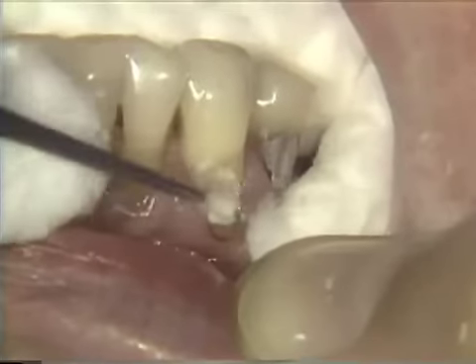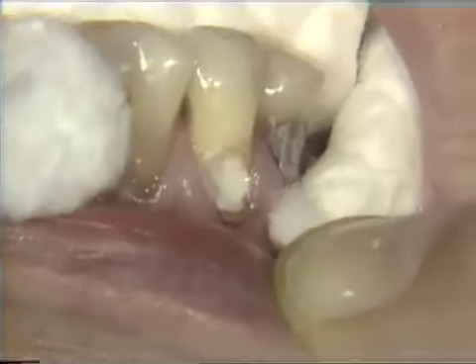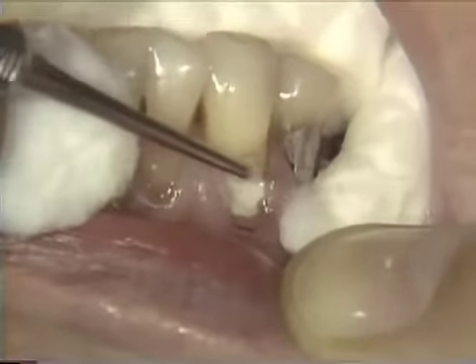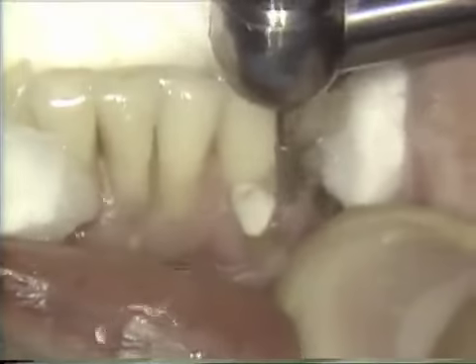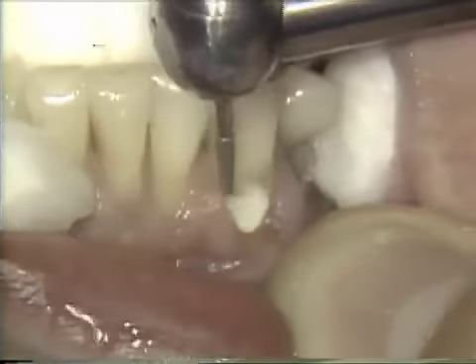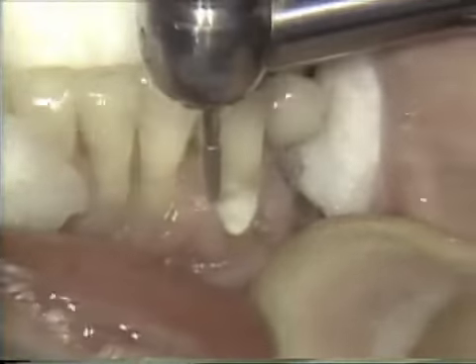With new cotton rolls for isolation, the glass ionomer cement liner is placed over all dentin and cementum. 3½ minutes after placement, the glass ionomer cement liner will be ready for etching. Excess glass ionomer liner is removed, and the incisal enamel is beveled with a diamond. A gel etchant is used for 60 seconds on the enamel and for 15 seconds on the glass ionomer.